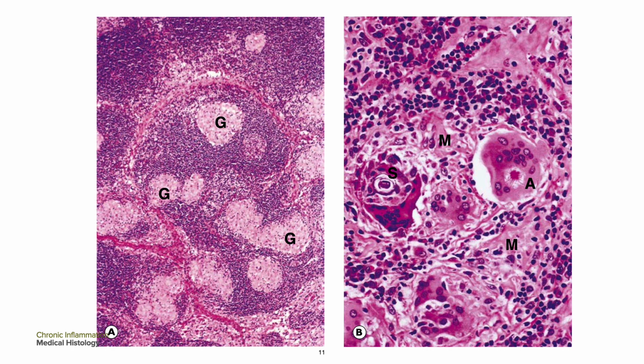Letter A illustrates a part of a typical lymph node. Note the scattered non-caseating granulomas in letter G, since there is no central mass of caseation. The sarcoid granuloma differs from the tuberculosis granuloma by having a much broader zone of epithelioid macrophages.